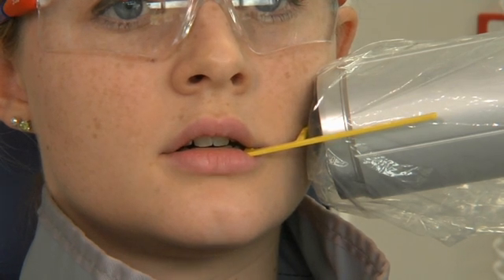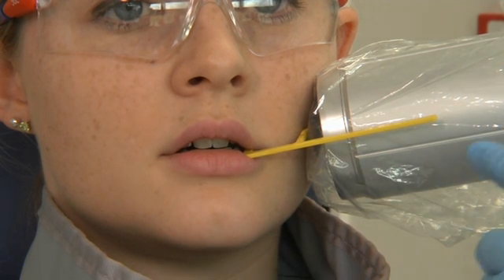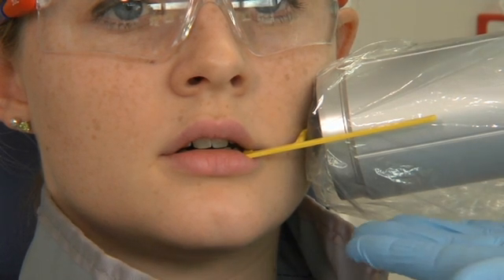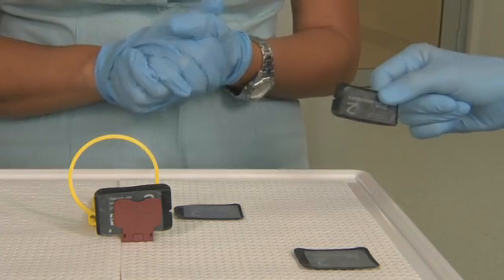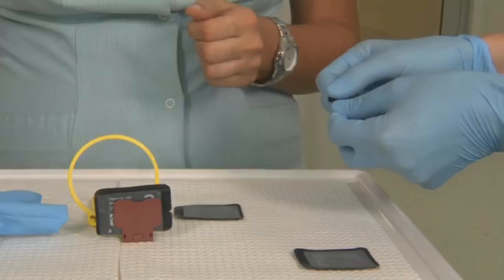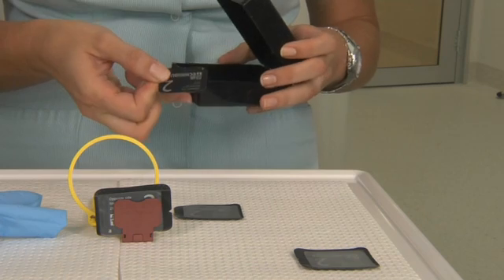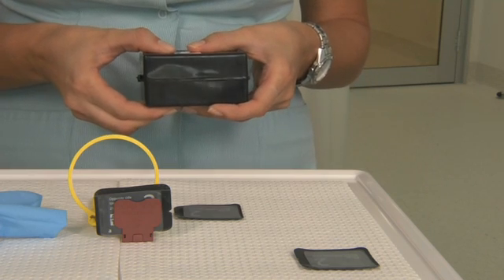The long cone is then positioned so that the handle of the x-ray is roughly parallel to the line on the long cone — this gives us a good guide for positioning. Also, you'll notice the patient's upper and lower arches are evenly exposed. We'll now pass the sensor plate across to our assistant, ready for processing. Please note our infection control measures at this stage: I'm passing the sensor plate to Jamel, who has clean hands. She's holding the sensor downwards away from the light and placing it free of saliva contamination into our black box, ready to be processed.